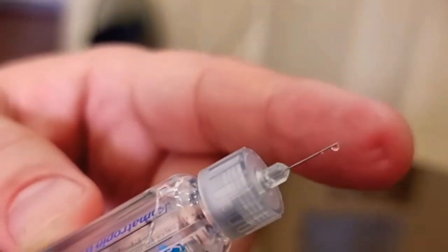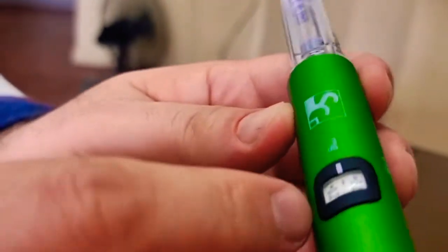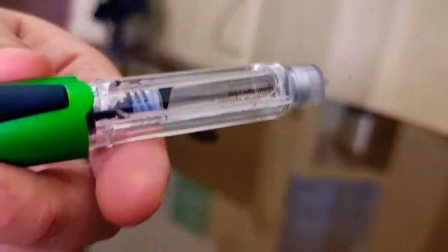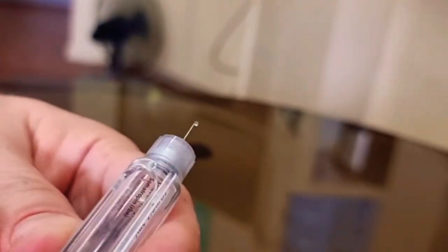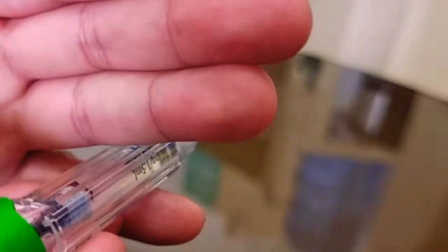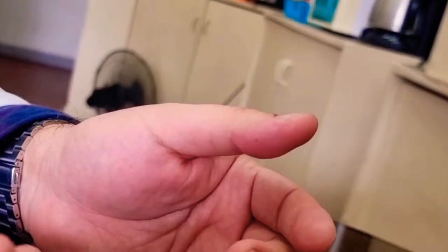And so this one, we already dialed before putting in the needle. As we can see, there's no need for priming because there's already a small drop there. It means that there's no blockade from the product and also the needle. So that's already dialed into 0.2. And so this should already be inside. And there. When you eject, doctor, you have to hold it for 10 seconds.